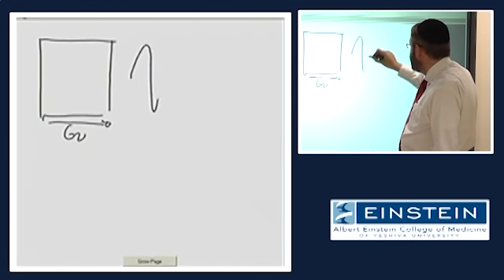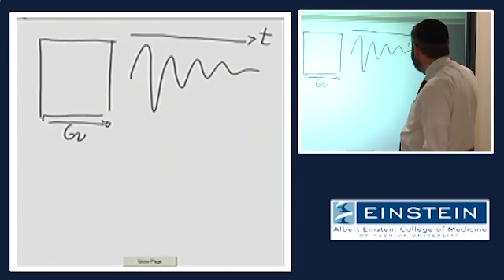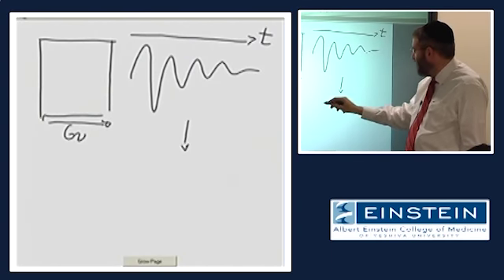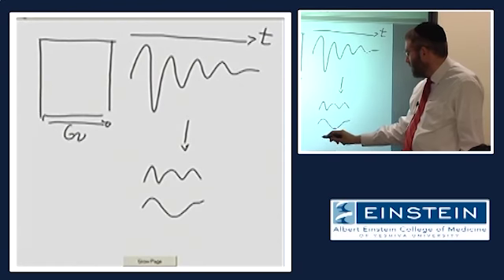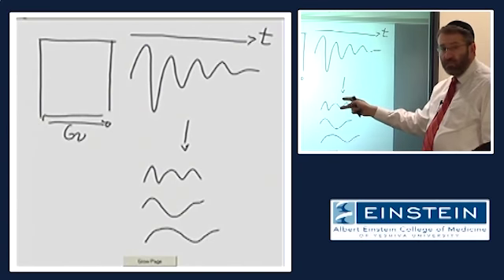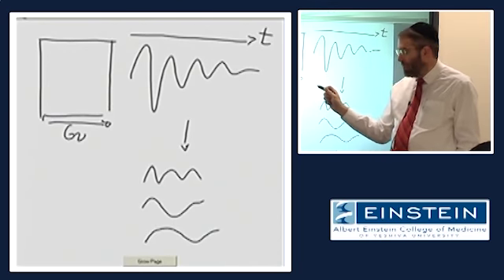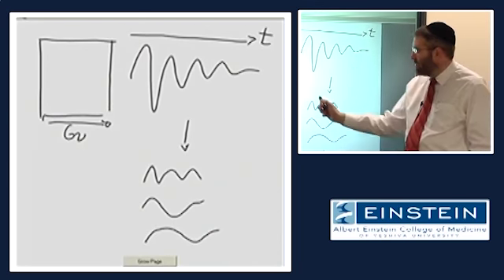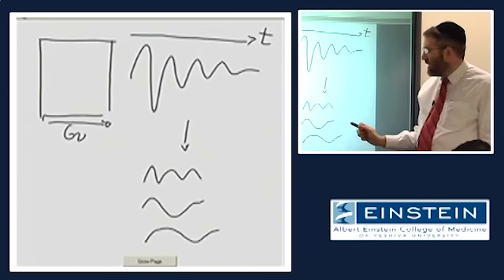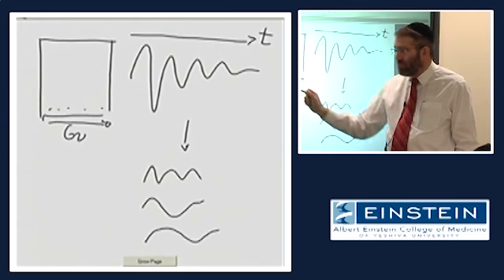So when we sample this signal over time, we will be able to take this and determine a series of different frequencies, each with a unique amplitude. Since those frequencies depend on the gradient magnetic field, this frequency information is spatial information. Frequency is location in MR. And we can take this result and localize our signal along this dimension in the image.